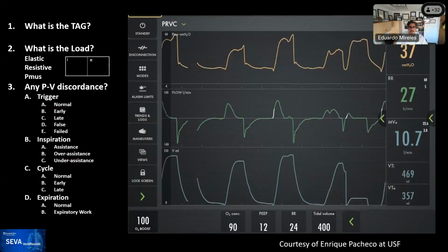All righty. I put in an extra one. We have 7 minutes, and he sent me 2, and I thought that this one was so painful that I had to put it in because it was important. So I think that it speaks to a couple of the items. I presume this is a different patient. I could not tell just because the settings changed radically. But the tag, I'm just going to accelerate that part because we already did that.